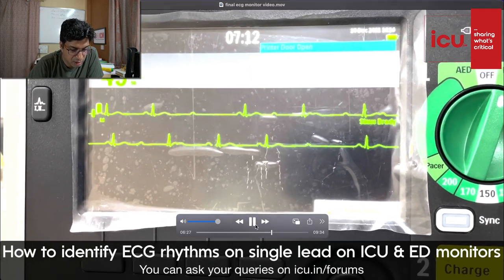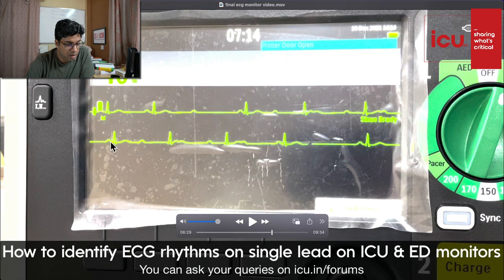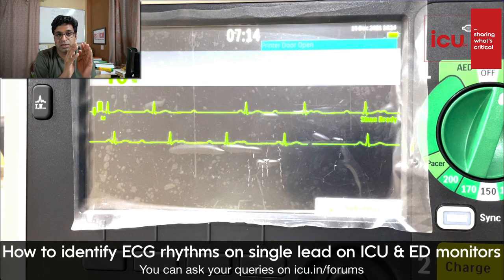I think there is some change here. You see there is a PQRS. This beat has a P wave, there is no QRS. Here there is no P, there is a QRS. There is a P wave, but not followed by any. The PR interval is irregular, here very short. So you can see these are P waves, 1, 2, 3, 4, 5. So P waves are marching at regular intervals, and QRS complexes are marching at their own intervals. So there is a complete dissociation. The P waves are generating at their own pace and the QRS complexes are generating at their own pace. So there is no connection between atria and ventricle. So it is a complete heart block, definitely going to require a pacemaker.